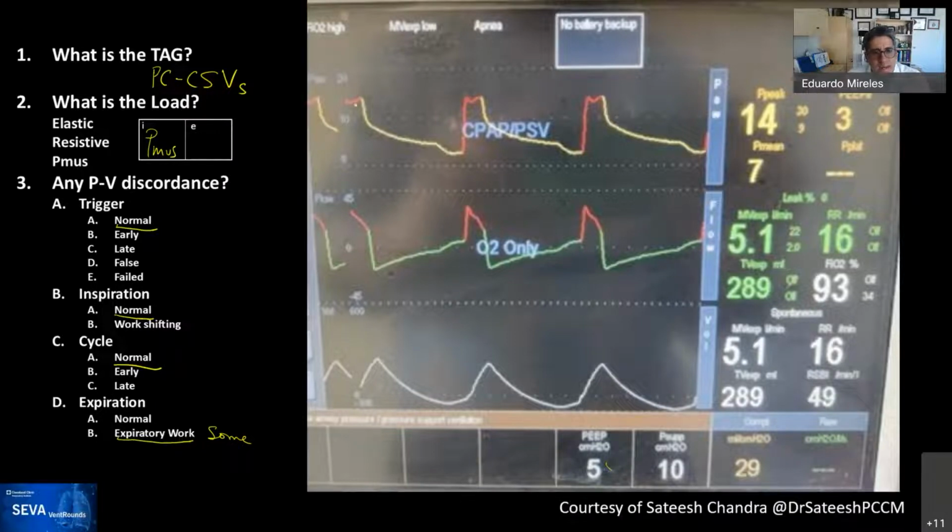I would say when I see this, I wonder for this ventilator, this is probably the case, that it changes color when it's triggered by the patient, and some ventilators actually maintain that until the patient cycles. So just pointing out what's cycled by the patient, triggered and cycled by the patient. And that may be also a clue of what you're seeing there.